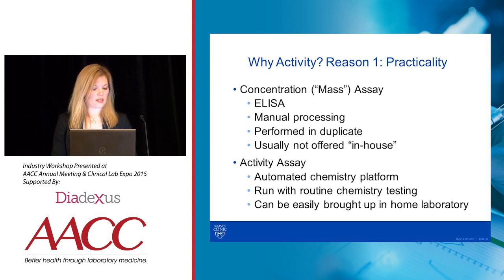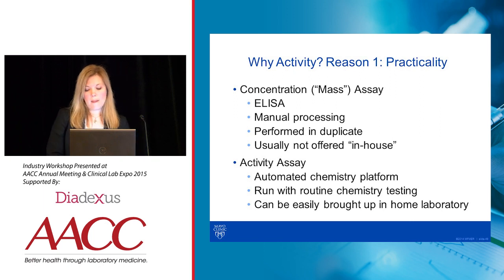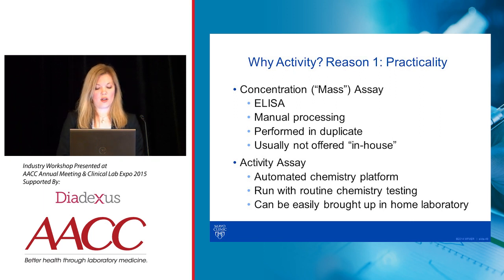The activity assay offers the advantage that it can be run on an automated chemistry platform, so it can be run with your routine chemistry testing, and so it's more easily brought up in a home laboratory on your automated chemistry platform.